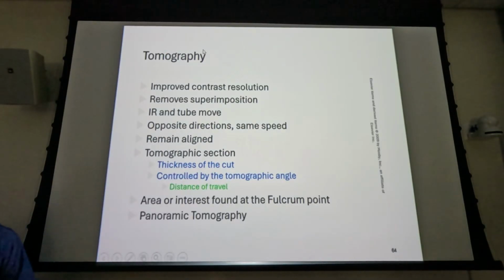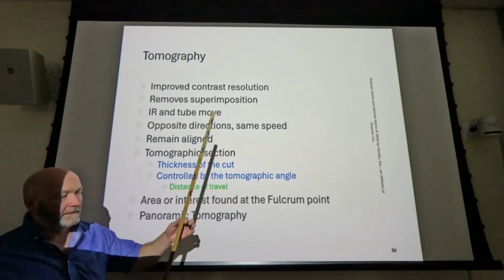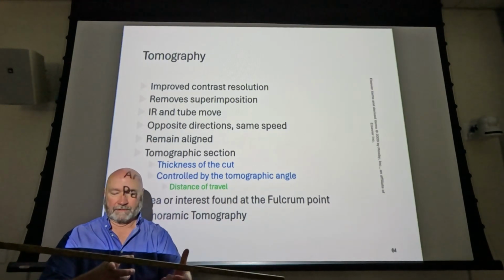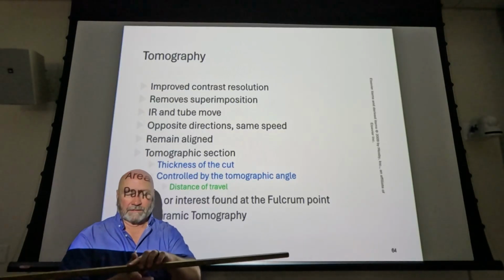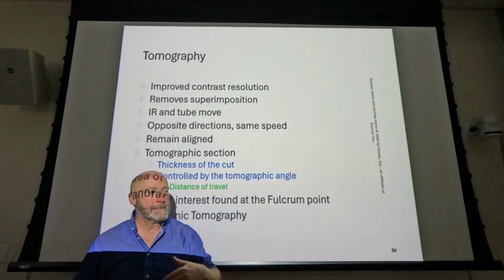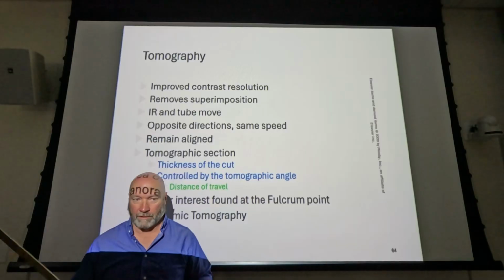Tomography, we're not going to spend a whole lot of time on this, but if you have aspirations to go to CT after you get out of X-ray school, CT is kind of this. And what CT does is, let's see, I find the center of this is roughly right there. Okay, so what CT does is it takes the concept of tomography and takes it to an extreme and attaches it to a computer so that you can do some reconstruction.